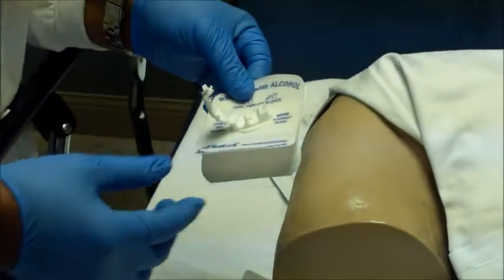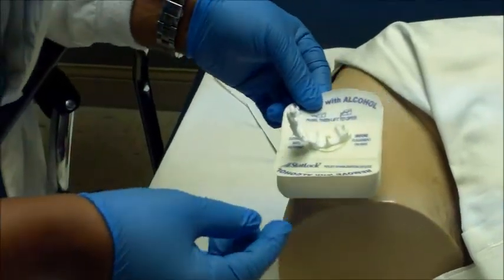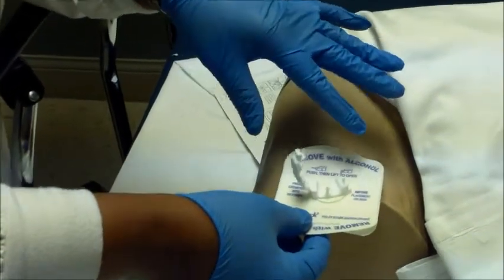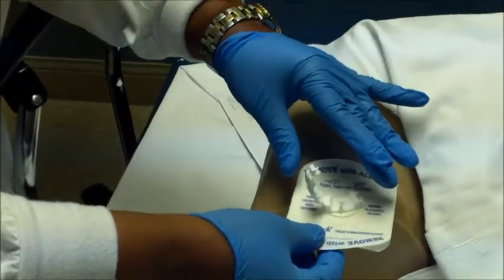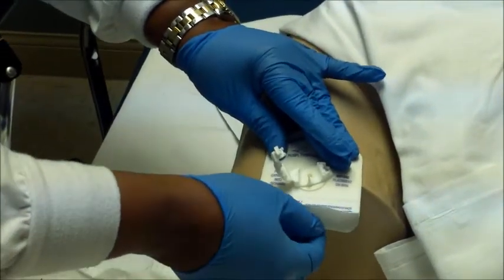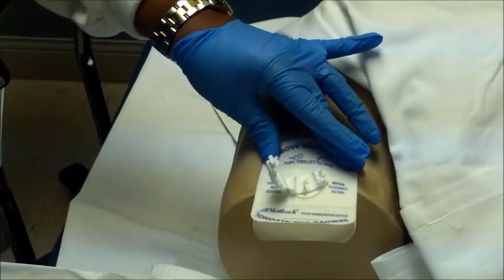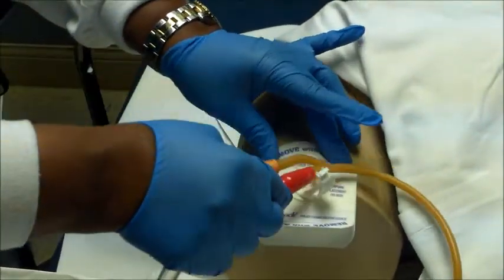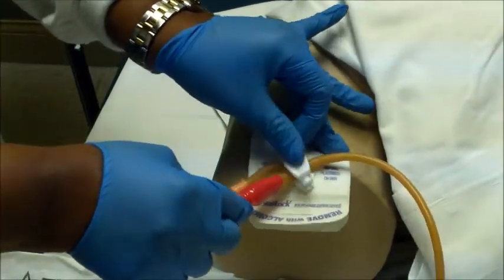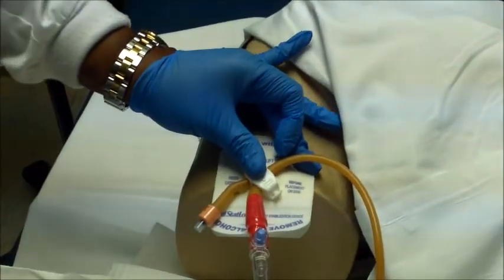You want to do a location and place it. You want to make sure that you have enough room with the Foley catheter. You want to place it on the inner thigh, more towards the left, closer. Now I want to remove this. Once it's placed and once it's secure, you want to lock down the Foley. Okay, and it's locked in place.